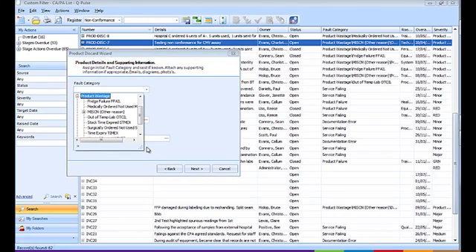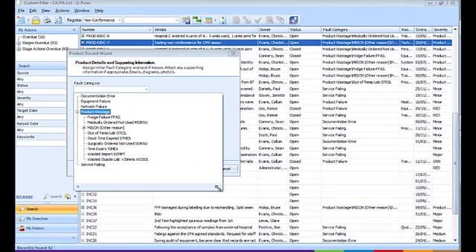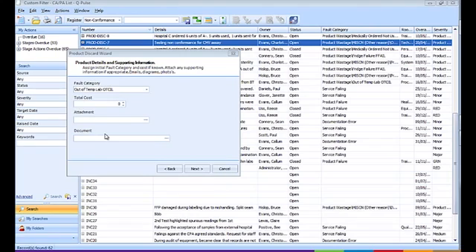If we drill down into the fault categories, we can record any fridge failures, we can use time expired, wasted import, but let's select out of temperature lab environment. We will record the cost as 4 times unit price of a single red cell unit, and if appropriate, attach any supporting information such as emails, diagrams, photos, any file type.